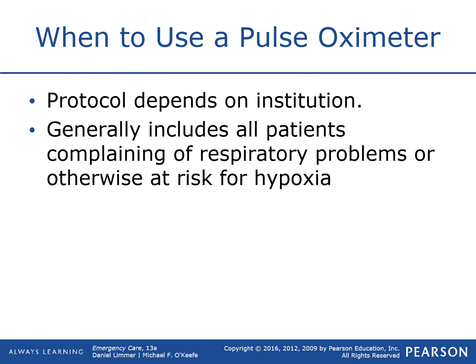So pulse oximetry use depends on your area and your department. Most departments in New York State, it is becoming a mandatory reading that you want to be taking on every patient. It, again, is a wonderful tool that can help assess the patient condition. It's not the end-all be-all, but it's a wonderful, wonderful tool that can help us tell if a patient is hypoxic or not. Even if you don't have a rule to use on every patient, you absolutely should use it on any patient that is having any sort of respiratory problem or anyone that you're suspecting might be hypoxic. Remember, hypoxic is low oxygen levels.